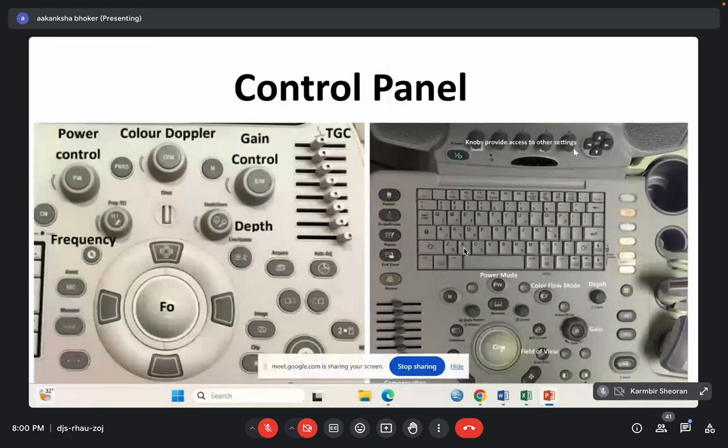Here also this is another control panel. Okay, in this you can see these round knobs. They are known as soft keys or functional keys because they do not have any function on their own, but the function is depicted by the mode. कि अगर हम एम मोड में करेंगे तो इनको अलग फंक्शन आएगा, स्क्रीन के बॉटम के ऊपर दिखाई देता है. बी मोड में करेंगे तो इन नॉब को कोई और काम आ जाएगा. ठीक है. So these are known as the functional keys.